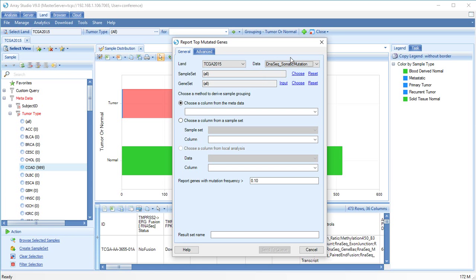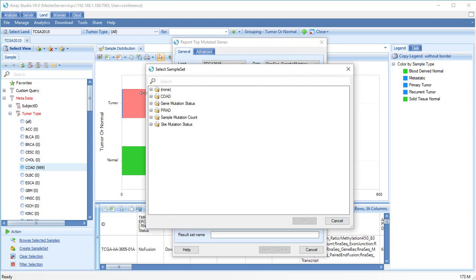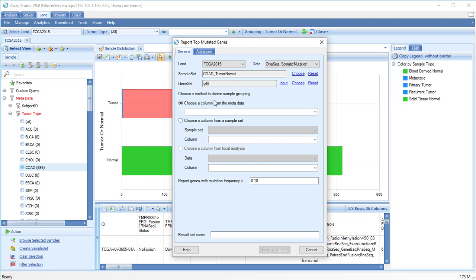We will restrict our search to our sample set. We can also search only a gene set. We will choose grouping from our sample set.